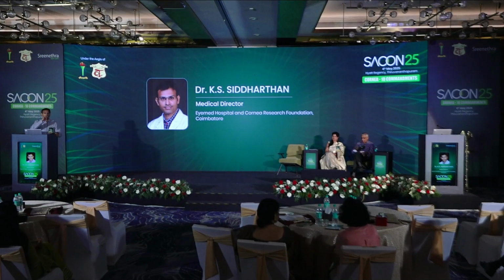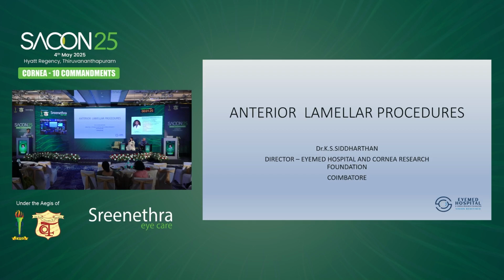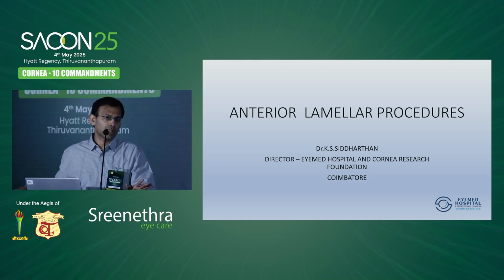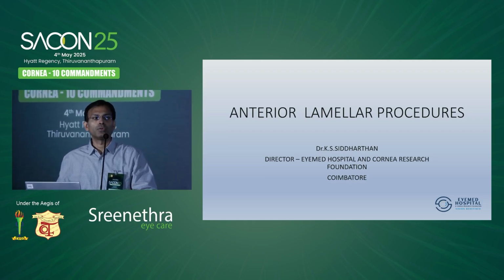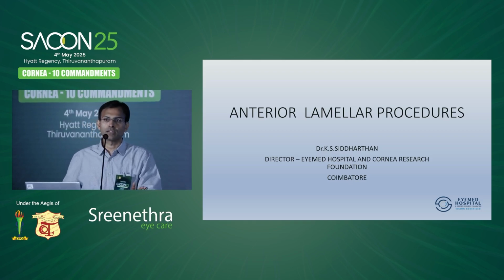So I'll be talking on two topics, DALK and DMEK. DALK is the deep anterior lamellar keratoplasty, where the first four layers are transplanted, and DMEK is exactly opposite. So the fifth layer is transplanted. These two surgeries are very successful surgeries. I'll share my experience and tips.